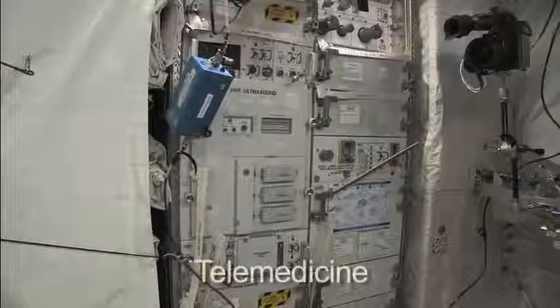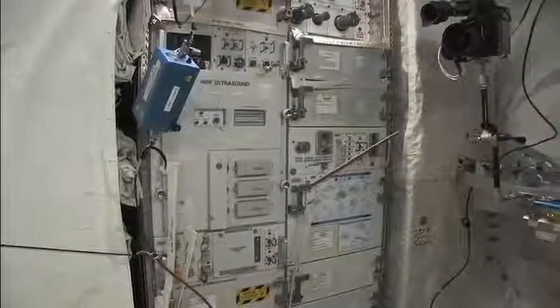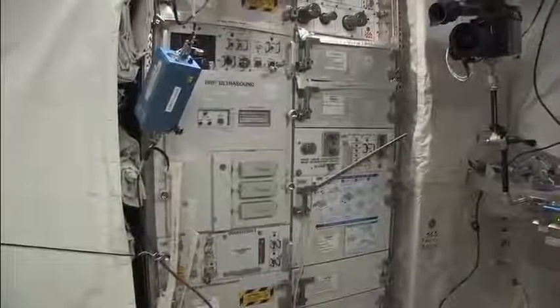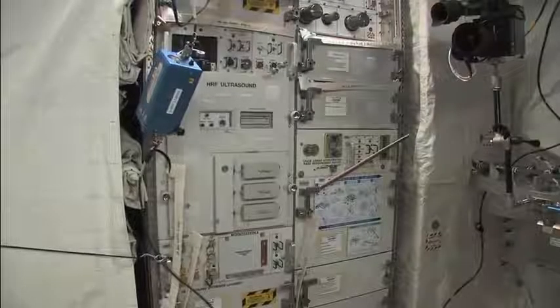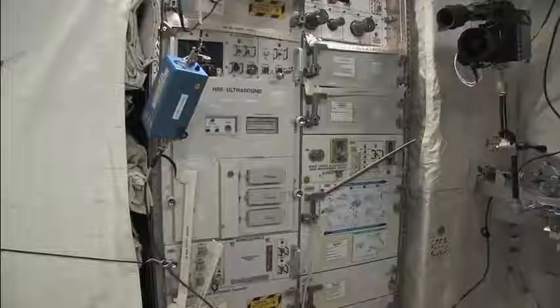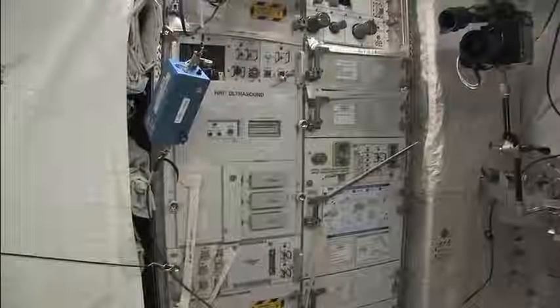At the same time, we're proving out some very interesting telemedicine techniques because, of course, we get some training on the ultrasound, but we're far from being experts in ultrasound technology. And when we do these experiments on ourselves, we're in contact with some experts on the ground who walk us through the procedures on how to get the ultrasound pictures that the experimenters need to interpret the data. And so you have a very good model here for how we might be able to implement some telemedicine, and we can take that information and feed that into the similar systems that are being developed around the world to bring healthcare to people in very remote places. So there's another good example of a synergy between science that we're doing on station to advance our knowledge, as well as a technology development program that can be used to help people on Earth.